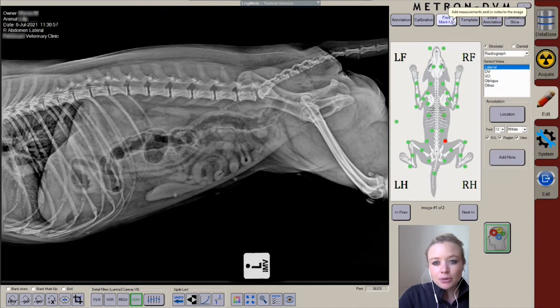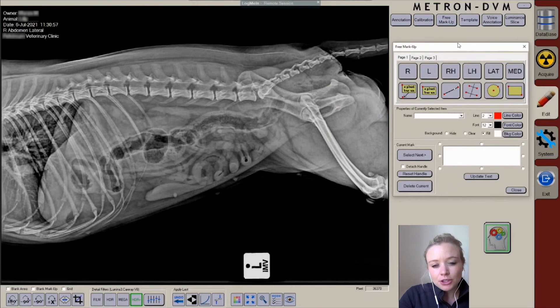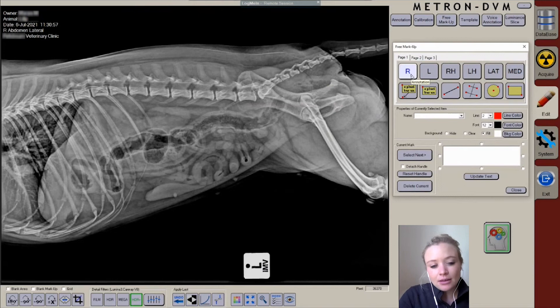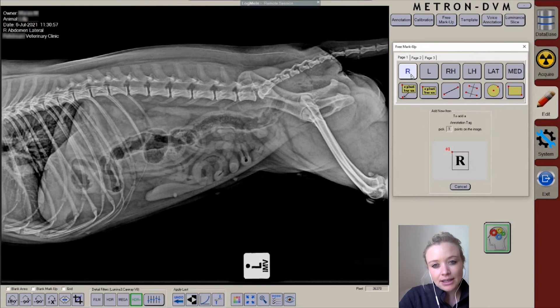We are then able to move to free markup, which allows for labeling certain structures, your right and left markers, and of course your measurements. Regardless of whether you have calibrated your image or not, you can still use annotations like your right and left marker.